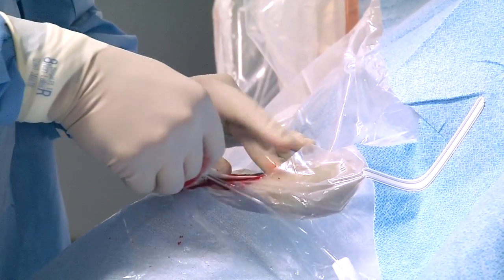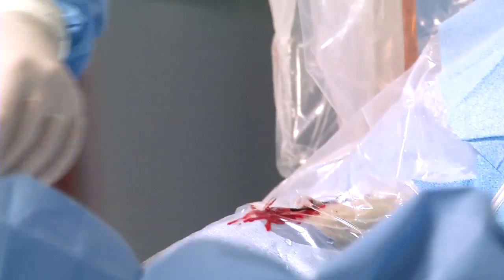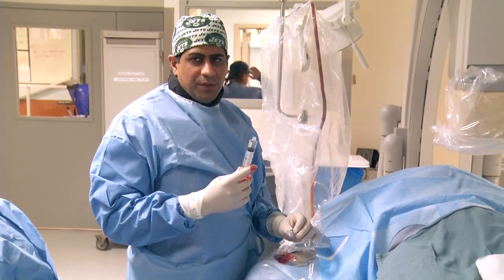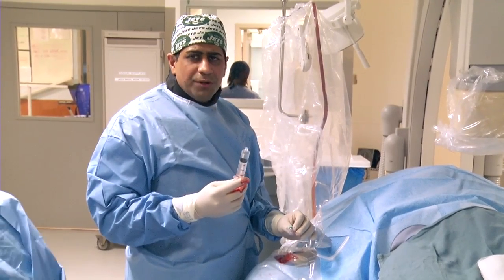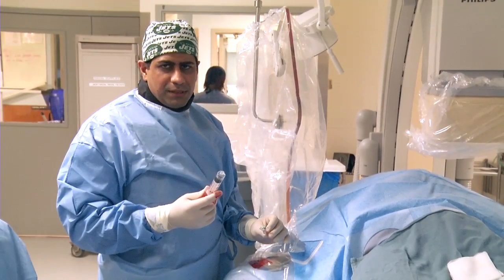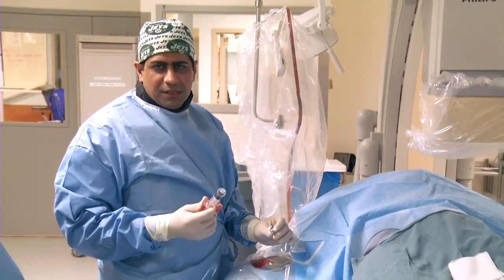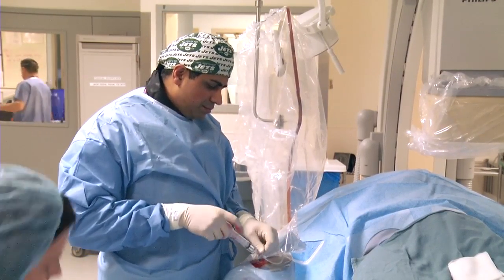Okay, and that's gone in smoothly. Once the sheath's in place, we have a cocktail that we give. The cocktail consists of 2.5 milligrams of verapamil, 200 mics of nitro, and about 2,500 units of heparin. Now the heparin is more weight-based, so it's a little bit more variable. The radial artery is a smaller caliber and more prone to spasm, so that's why we give this cocktail.